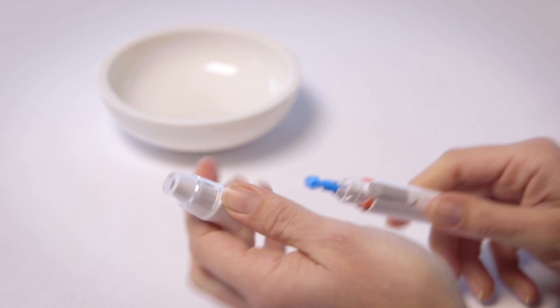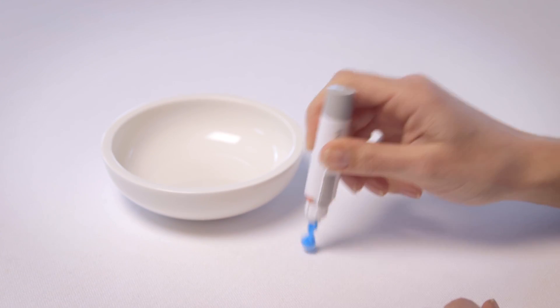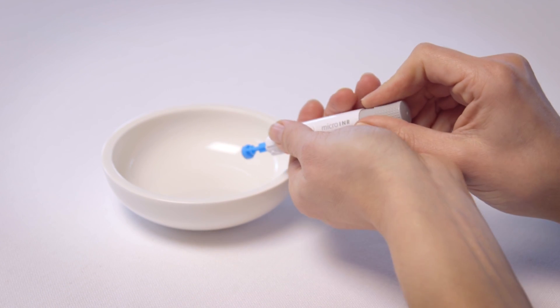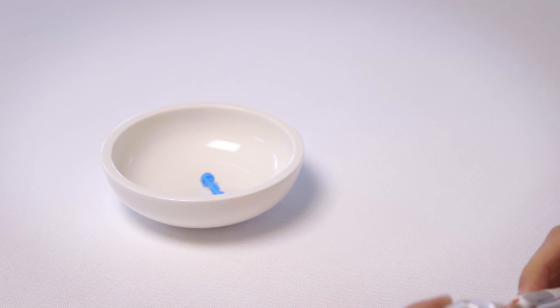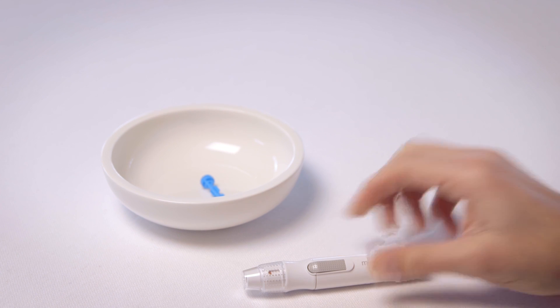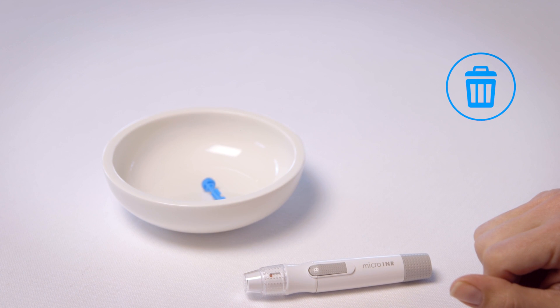Remove the cap from lancing device and stick the lancet into the safety cap of the lancet. Press the release button and pull plunger at the same time. The lancet ejects safely. The chip and lancet can be disposed of in your regular household waste.